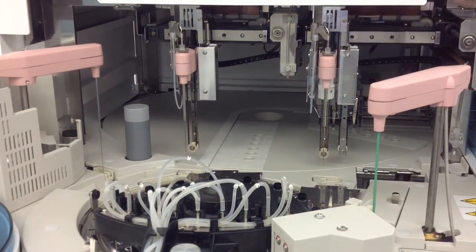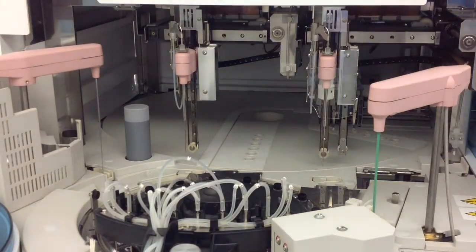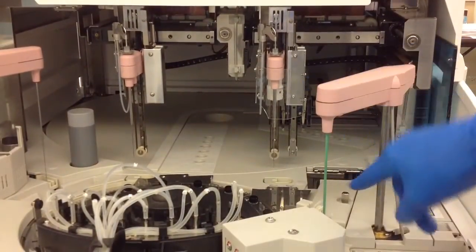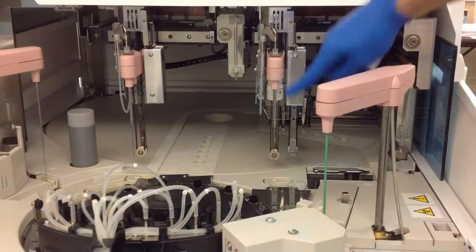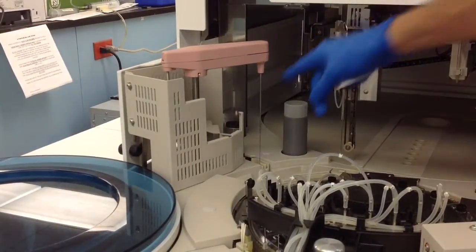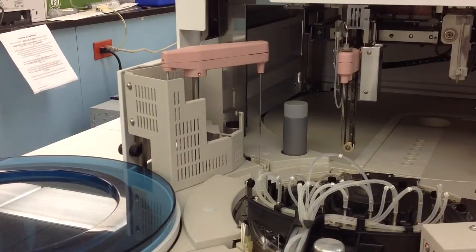Now the first thing you can go ahead and do is clean all the various probes with alcohol swabs, and that's going to be the ISE probe, the ISE sipper probe, the reagent probes, and the sample probe off to the left, and then there's a sample cover that you have to clean as well.